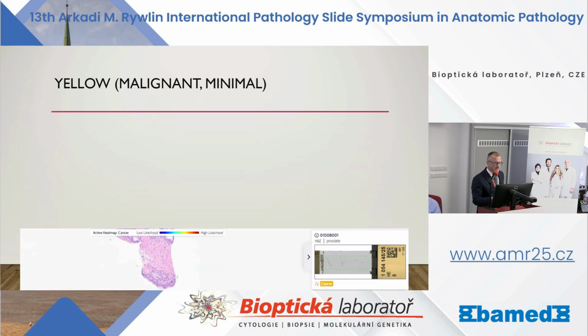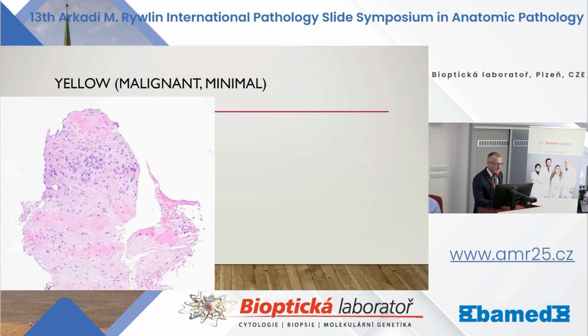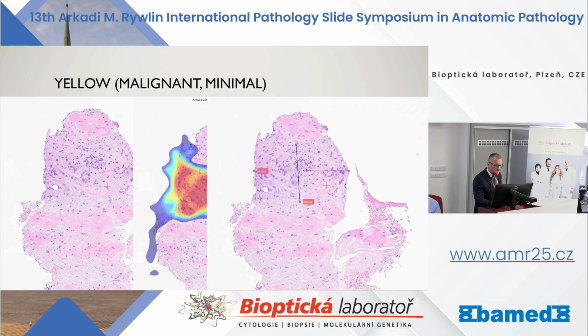You can get minimal carcinoma, like here, which is a small focus of 4+4 carcinoma, marked like this, and it's just 0.4 times 0.2 millimeters. So when you are at the end of your day after 10 hours and more than 100 cases, you can miss something like that. You shouldn't, but we are only human.